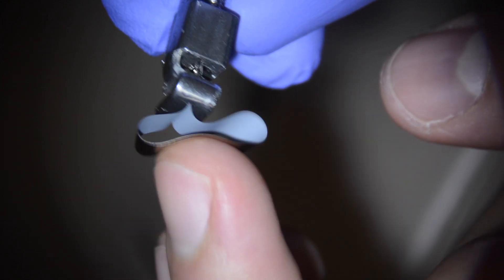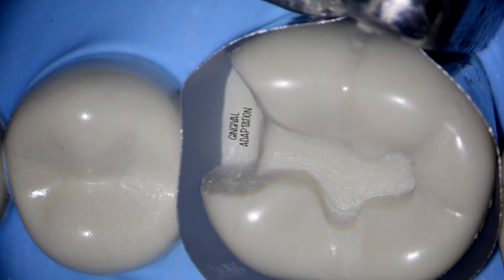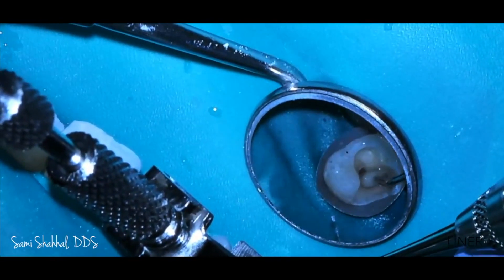What a lot of you may not know is that they have Toffelmires that are thin. These ultra-thin Toffelmires are what I use if I choose this system over the sectional matrix system. The thinness of the band helps me create a very tight contact and it adapts incredibly well to the gingival margin of the tooth. However, because it does tend to flare out, it doesn't adapt well to the buccal and lingual proximal walls, which makes it harder when I'm finishing my restoration after light curing the composite.